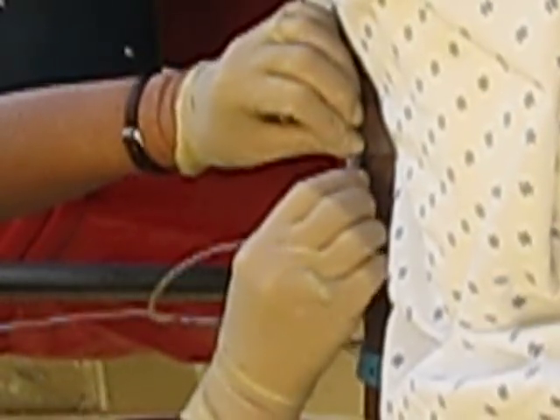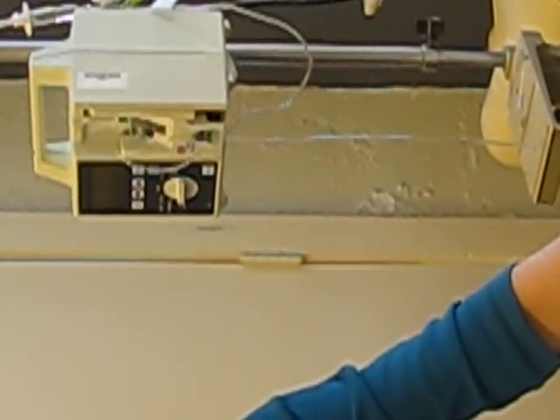Let's go ahead and lock it down. There's a little lock on this, so let's use it while we've got it and lock that down. Now you can go ahead and secure it at this point, or you can go ahead and start your machine. Let's go ahead and start your machine, because the longer you don't have that fluid running into the patient, the greater the possibility of a clot forming at the end of that catheter.